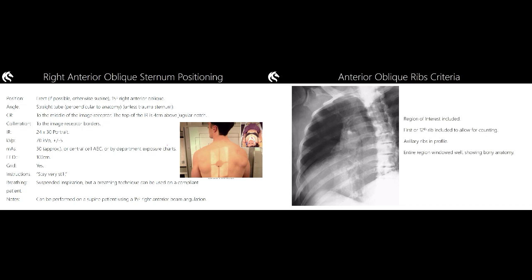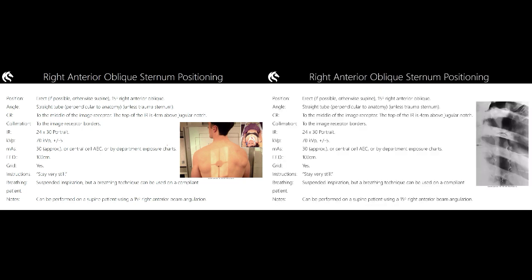erect bucky here, and it can be hard from behind to know the amount of rotation I need to do and amount of movement of the patient I need to do to get the sternum in the middle. So what I'd suggest is, even if you're a shorty like me, is to have one hand on the patient's spine, one hand on the patient's sternum, and then to rotate it, making sure that the sternum hand is over the midpoint of the erect bucky. Okay? That way you'll know that the structure in question is going to be centered well.